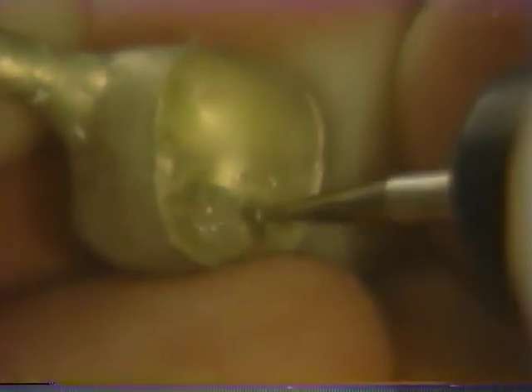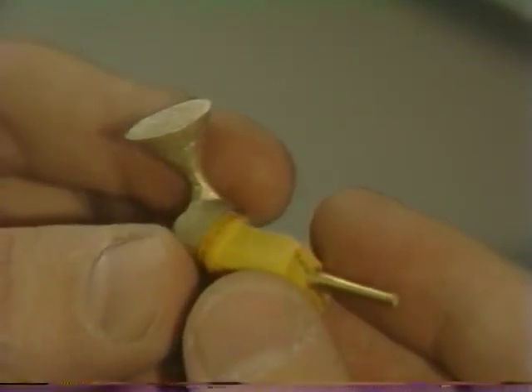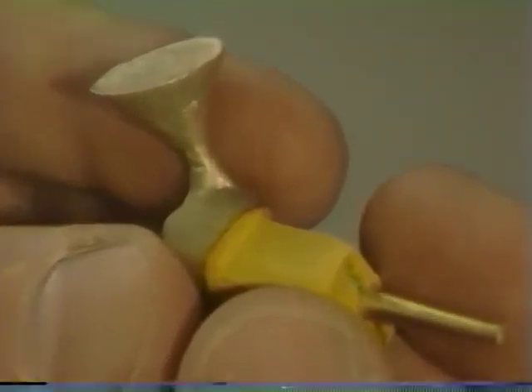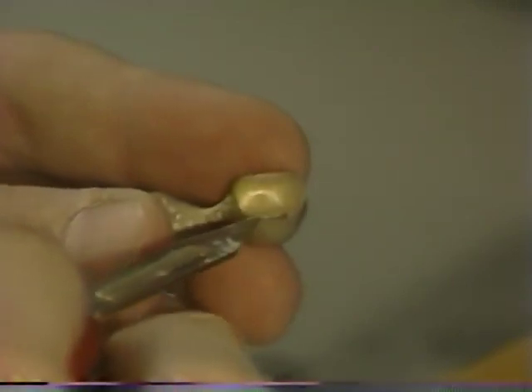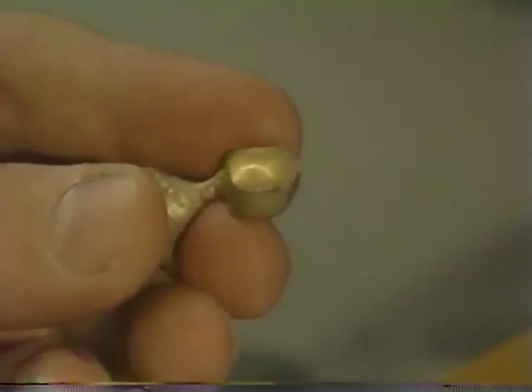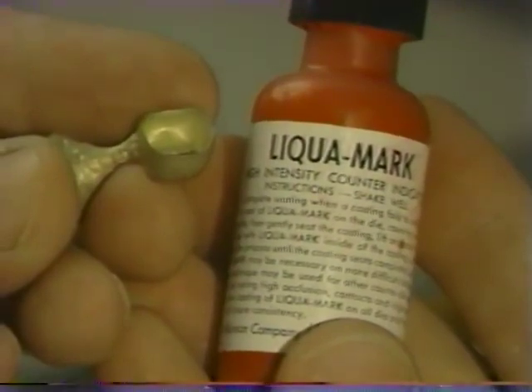Whenever the internal surface is adjusted, be very careful not to damage the margins — good finger rest positioning is critical. Once all nodules and any other voids have been removed, the casting is carefully tried on the die until some resistance against vertical displacement is felt. The casting is then removed from the die and again the internal aspect is inspected to see if it can be determined visually where it may bind. If such is not possible, a marking agent — typically a water-soluble paint — can be used to coat the inside of the casting.